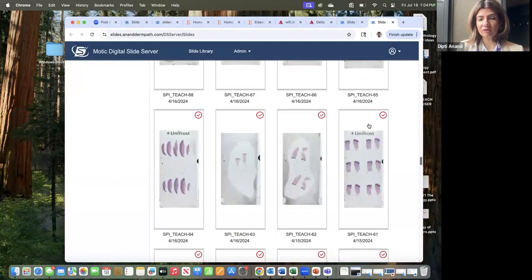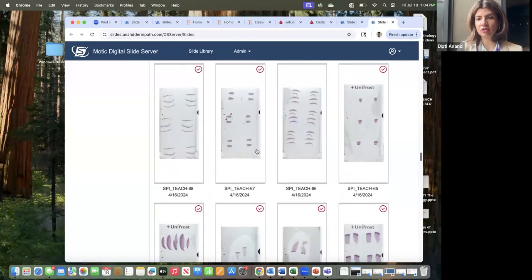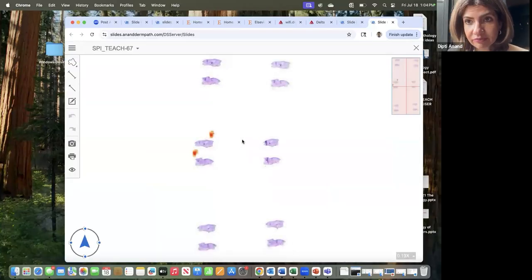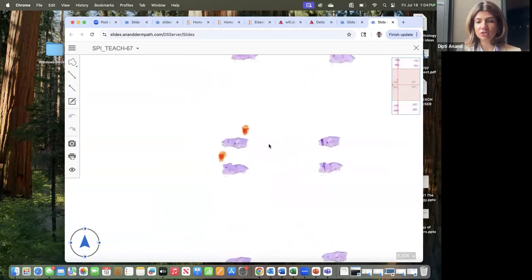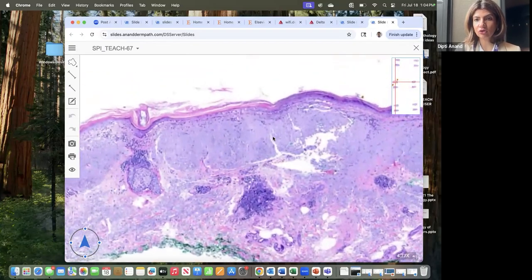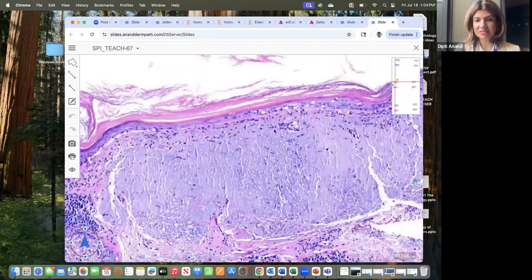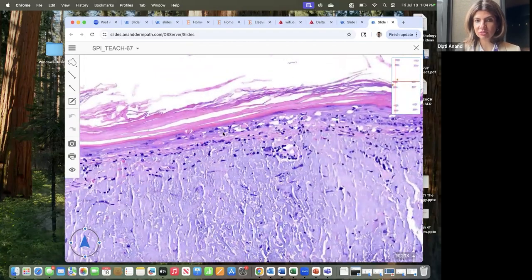Okay. Now let's come to your next group of diseases, which will be your interface vacuolar diseases. Interface vacuolar diseases are the group of diseases wherein you are basically getting vacuolar alteration without the lichenoid infiltrate. So you're getting the holes and the spaces in the DE junction. You have seen the holes and the spaces with the dead cells. Now, interface vacuolar is classified as acute and chronic, but that doesn't mean the onset in the patient. It means what you are seeing under the microscope.